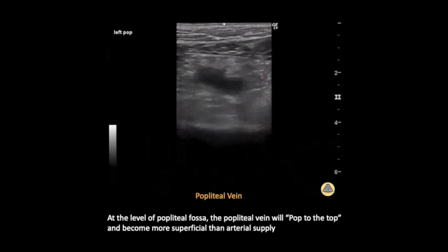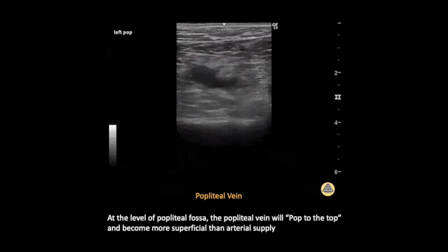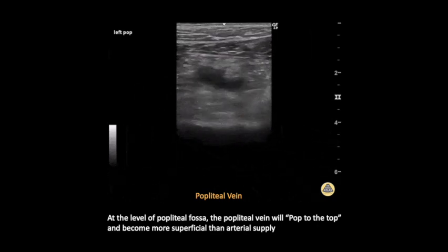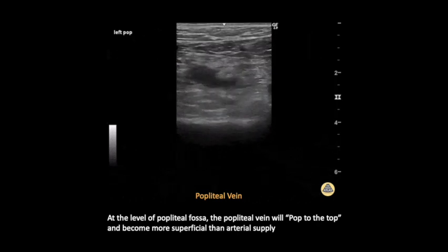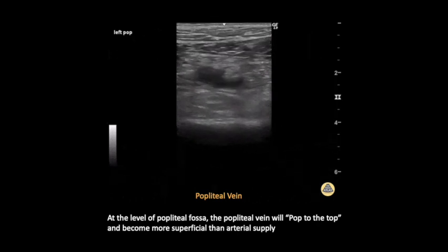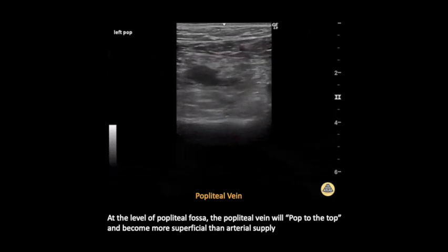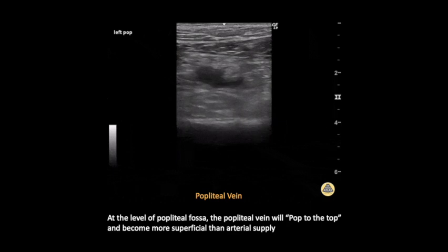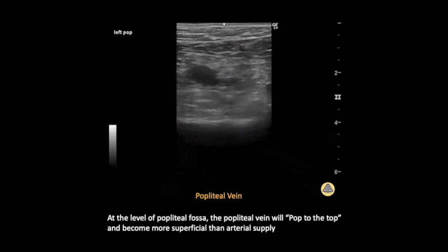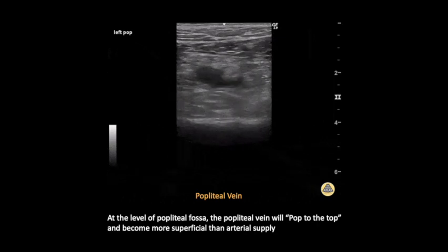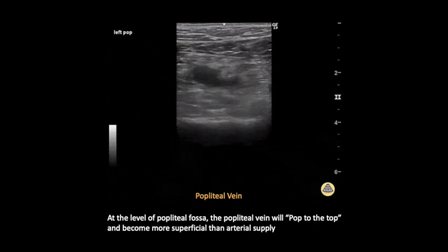Here's an example of a popliteal deep vein thrombosis. Remember that in the popliteal fossa, the vein will be located more superficially than the artery. Although with sufficient pressure we can approximate the walls of the popliteal artery and still see its pulsatile nature — and color flow could confirm that is the artery — the DVT is seen by the lack of compressibility in the more superficial popliteal vein. This is a common area where learners fail to recognize DVTs, which is why I keep emphasizing the 'pop to the top' mnemonic.